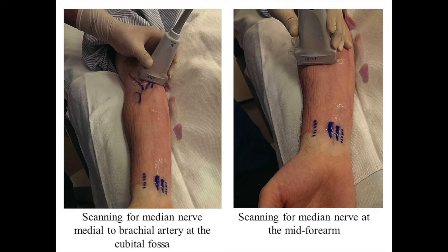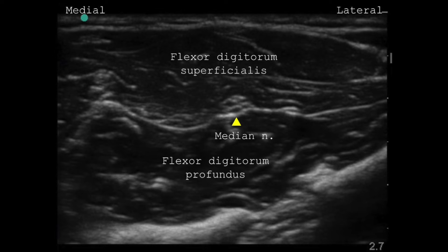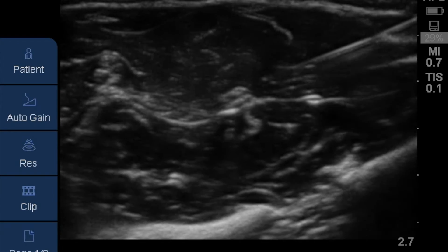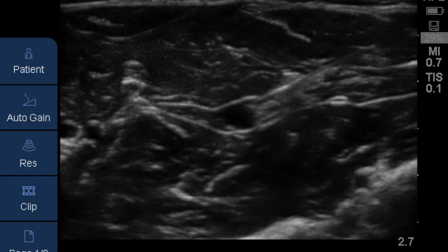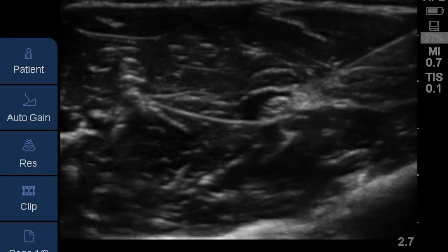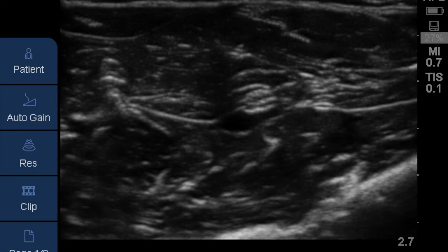For a mid forearm block of the median nerve, the patient's arm is positioned straight and supinated. A linear transducer is placed on the ventral aspect of the mid forearm where the median nerve is visible in the fascial plane between the flexor digitorum superficialis and flexor digitorum profundus. A 22-gauge, 50 mm short bevel block needle is introduced in plane or occasionally out of plane, aimed at the fascial plane next to the median nerve. An injection of 5 mL of local anesthetic is made after negative aspiration to cover the nerve circumferentially.